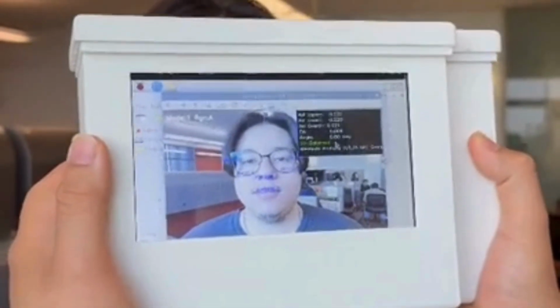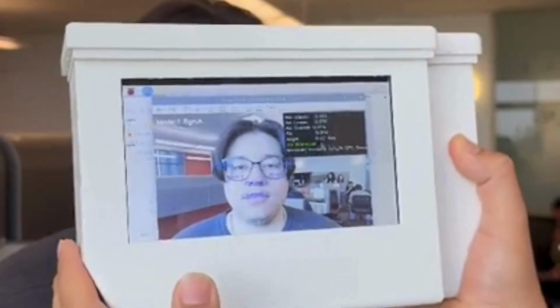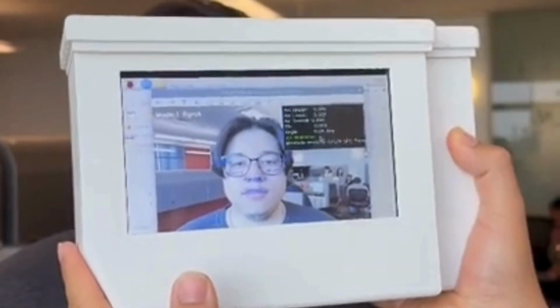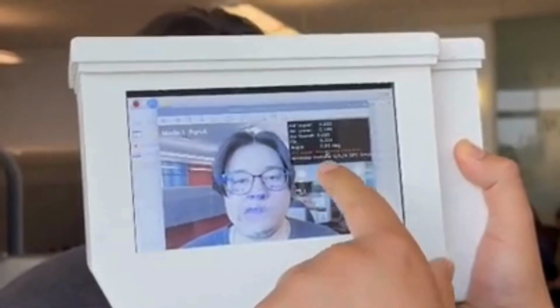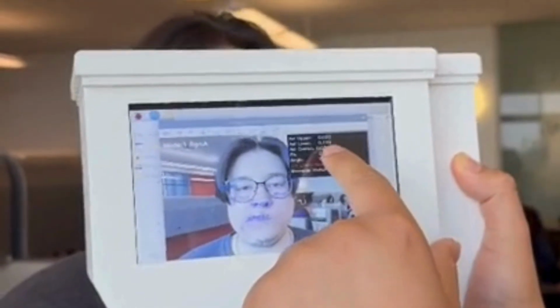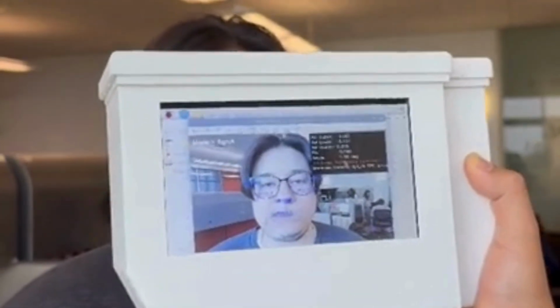Okay, so here we have a balanced face, and we see the asymmetrical indexes are pretty low. Now I'm going to ask Jerome to give us a lower asymmetry, so give us a droop effect. We get that lower asymmetry is detected, and we see our ASI lower is a higher number because we have that distance formula that's a little wonky.